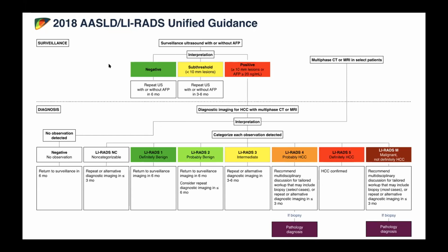Now, the dominant technique amongst that is MR, though it's restricted to some institutions, what we call abbreviated scanning protocols. Now, the abbreviated scanning protocols are of 2 types. One where you can use contrast, and that contrast is typically not an extracellular agent, but an intracellular agent like Eovist, or you could have a non-contrast technique which could be used as a surveillance.